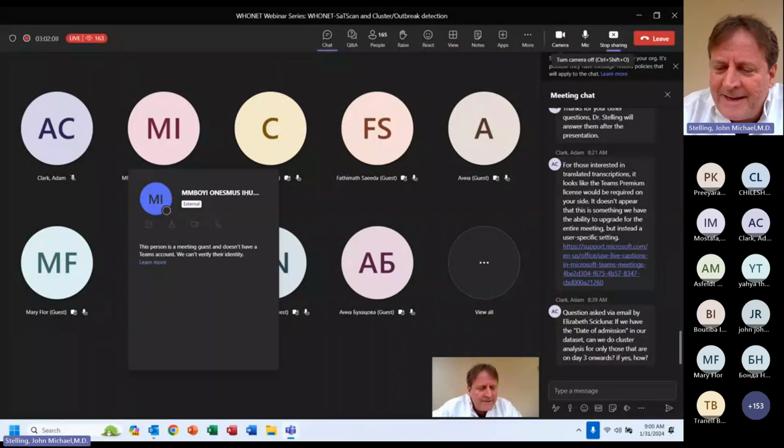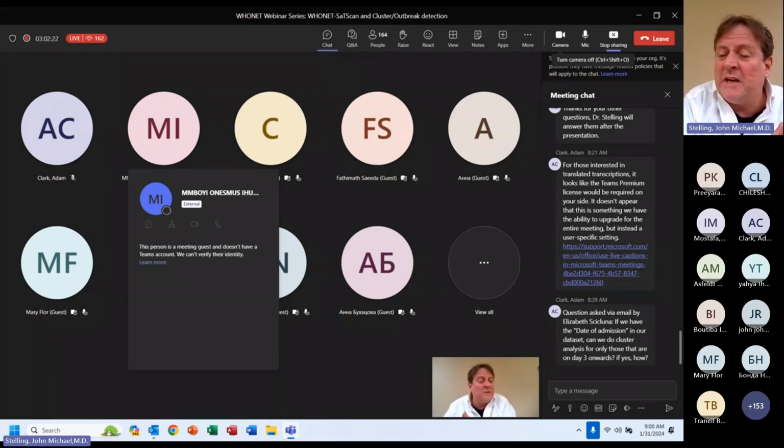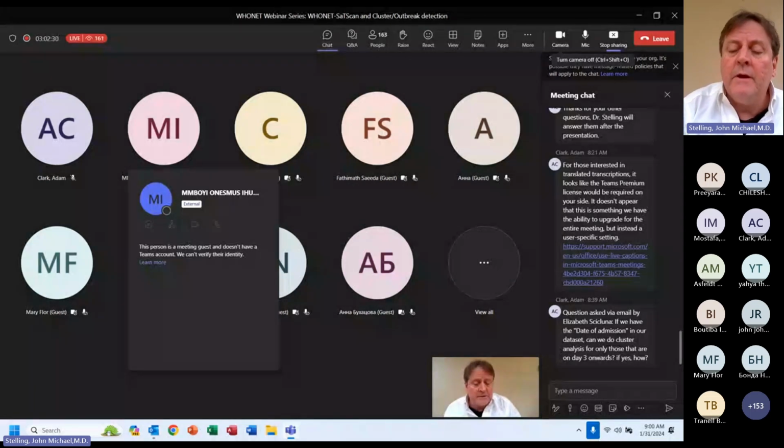Oh, hi, Liz. Sheikh from Malta asks: if we have date of admission in our database, can we do cluster analysis for only those that are on day 3? Yes, you can do that, and I will discuss that on the next webinar. Today I just did simple filtering. I just did first isolate per patient. All of those clusters I showed you were a potential mixture of inpatient and outpatient results.